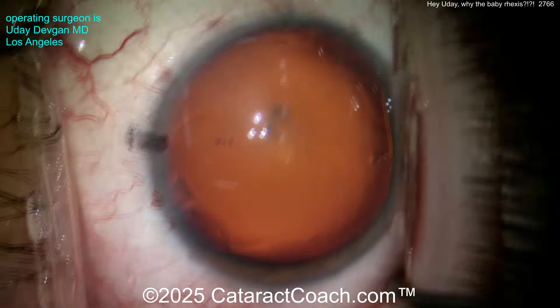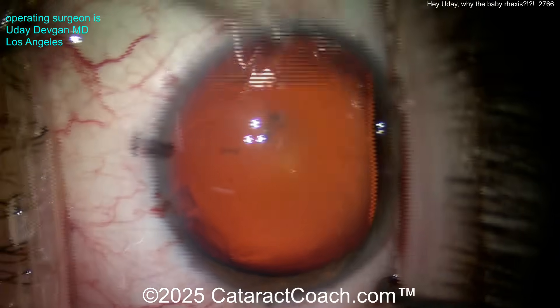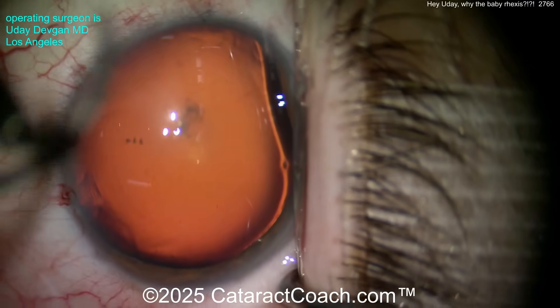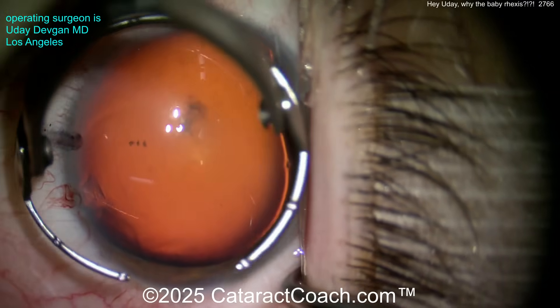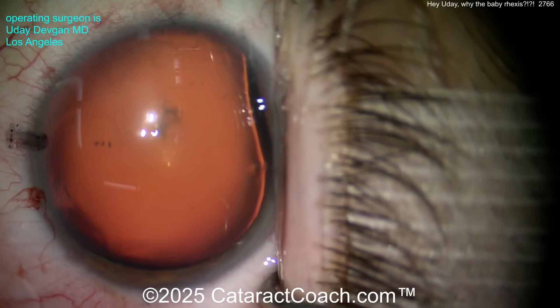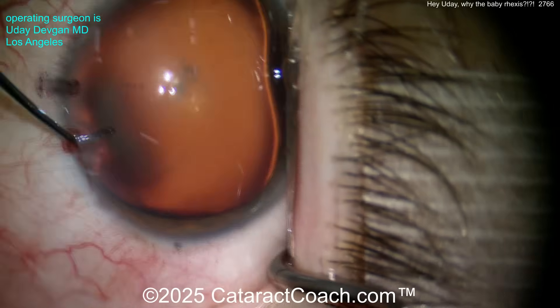The patient's going to move a little bit — don't worry about that, we're used to patients who dance. Now look at this as we put the fixation ring down. It's a very large eye. We'll have the patient try to look down a little bit to get the fixation ring seated. You can see this patient has a very large white-to-white.